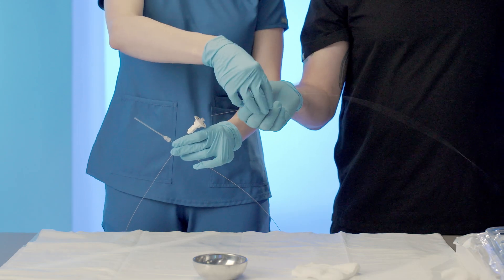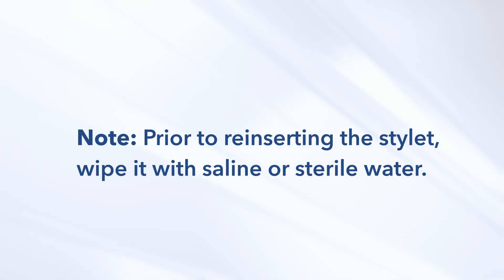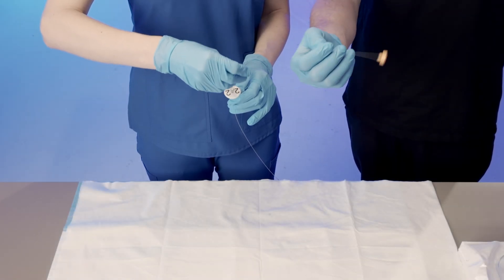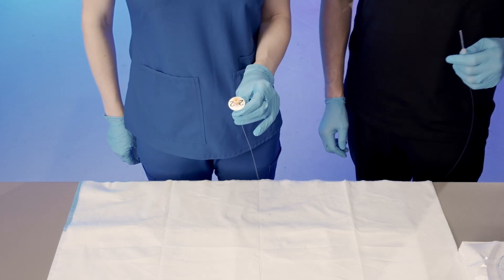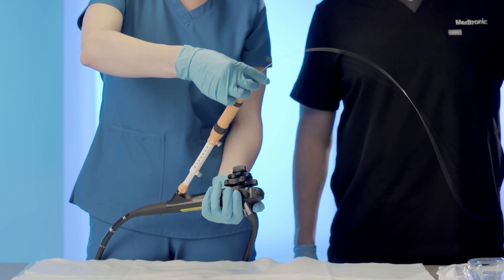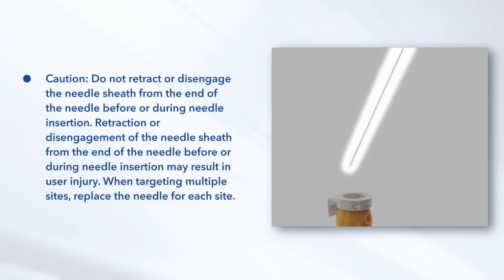For additional tissue sampling from the same lesion using the same needle, gently reinsert the stylet into the luer fitting on the needle. Prior to reinserting the stylet, wipe it with saline or sterile water. While holding the needle luer fitting, advance the stylet in small increments until the stylet hub engages in the needle luer fitting. Tighten the stylet hub onto the needle luer fitting by rotating clockwise. Carefully insert the end of the needle with the needle sheath into the handle in short increments until minor resistance is felt. Do not retract or disengage the needle sheath from the end of the needle before or during needle insertion.